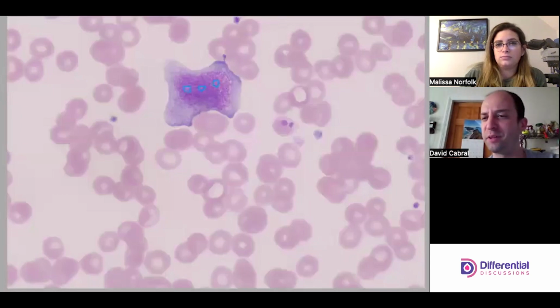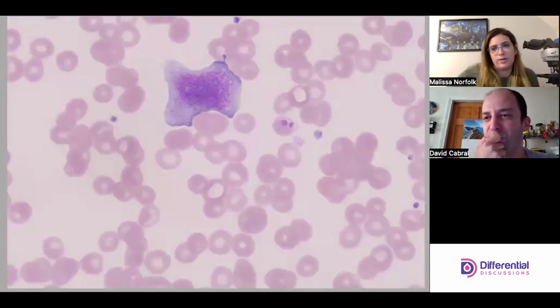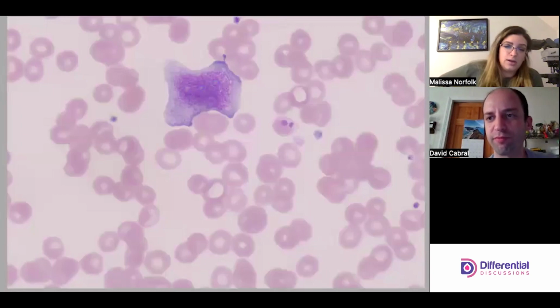What's a remnant? Have we talked about remnants before? I don't know if we've talked about a remnant. So a remnant is a nucleoli that's kind of closing up, shutting down shop. Remember, nucleoli is where the DNA is unwound and it's going through the process of being made into RNA. So it's closing up shop. That one is not really doing the process anymore.